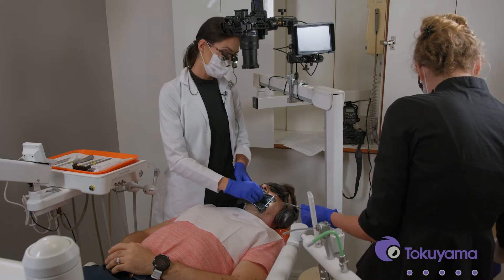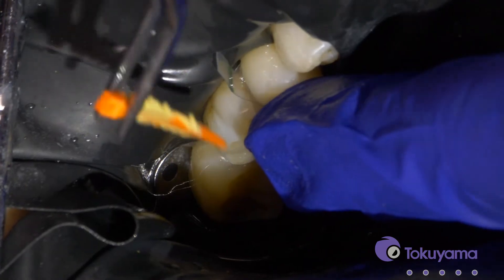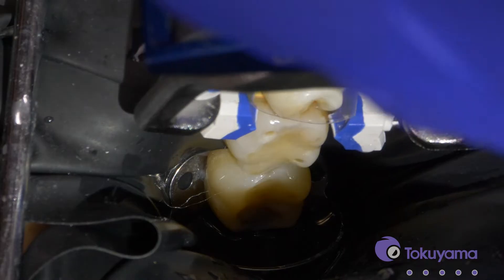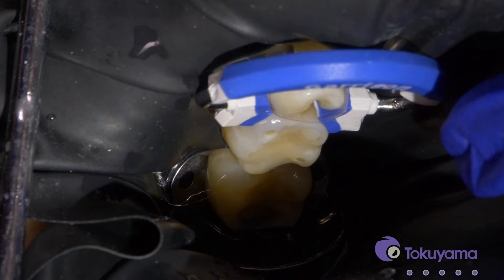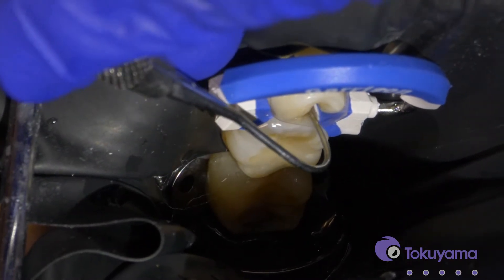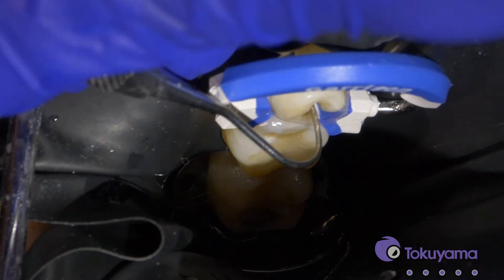I'm going to place this clear sectional matrix band. I really like using the clear one — it has a really nice shape to it, and that will help get a nice contour to the tooth. Now we'll put the wedge back in and place the Garrison matrix ring to get a little bit more separation. I like to warn the patient that they may feel some pressure at this point. The only real drawback with clear matrix bands is you don't really see if you have the wedge sticking out or a void on the gingival. So I just take the Explorer and brush it around there to make sure I don't have a void. It looks really nice.